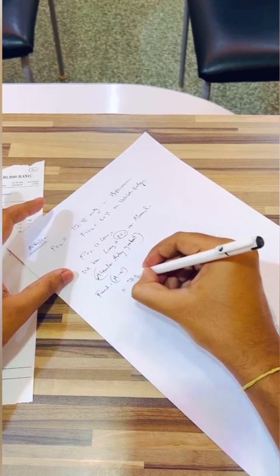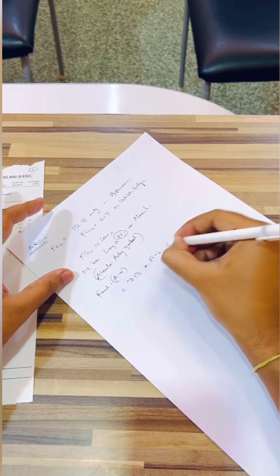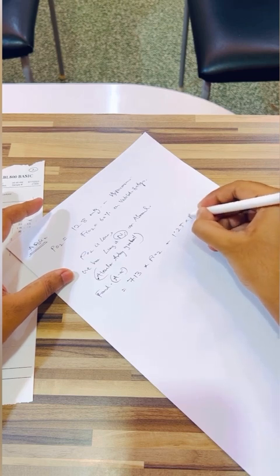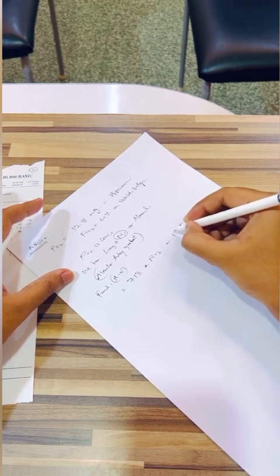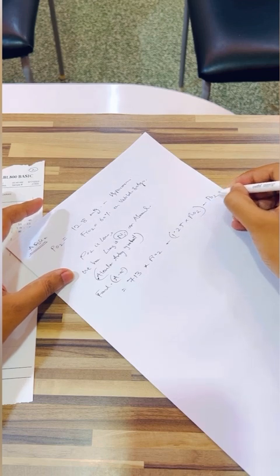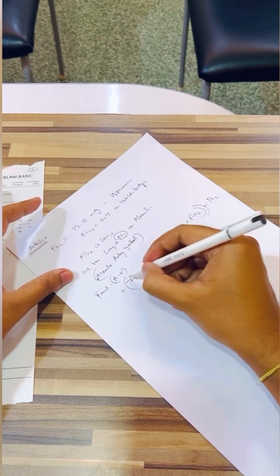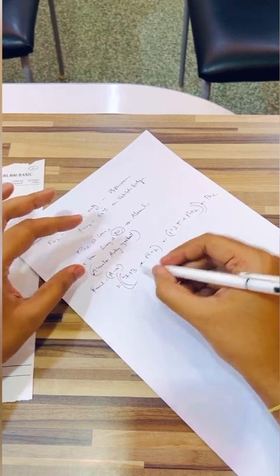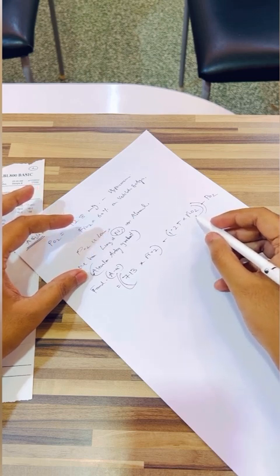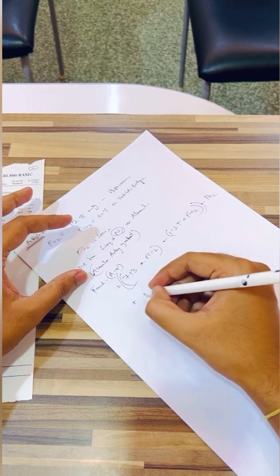It is 713 into the FiO2 minus 1.25 into PCO2, and minus PO2. So, 713 into FiO2 and then minus 1.25 into PCO2, and all together we have to subtract with PO2.